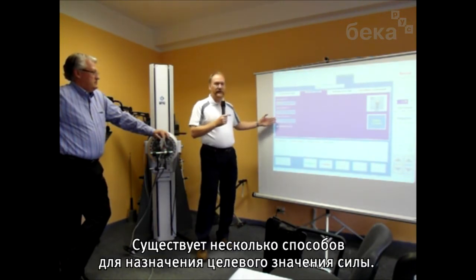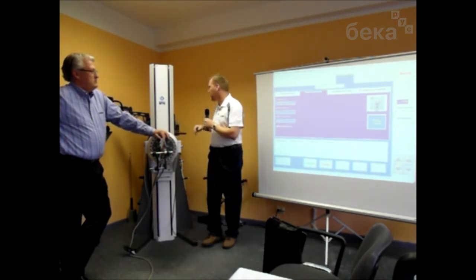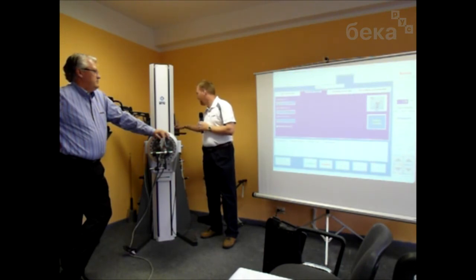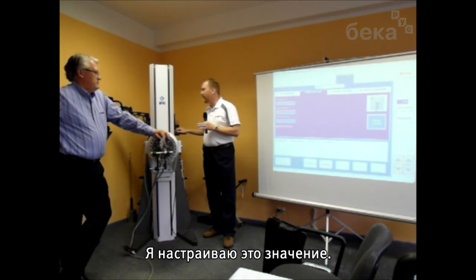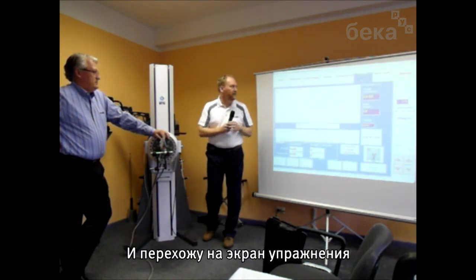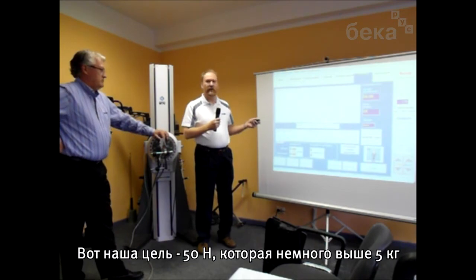For the target force, there's a couple ways you can approach setting the target force. You can just simply set it to a value that you want to use for that person. So if I wanted to say go to 50. Okay, I was going to do 20, but we'll do 50 for it. 50 newtons, which is about 5 kilos. I can preset it to that value, save the setup, and then when I go to the exercise screen, there's our target of 50 newtons, which again is about 5 kilograms.